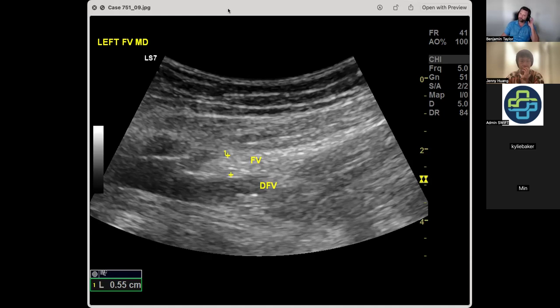But as time passes, there's a number of things that can happen. It gets brighter, it can recanalize, and you can get a more central channel. But also, if you think back to the DVTs you've seen, are the veins big or small? The clotted veins. Acutely big, chronically small. Yeah, so they shrink. Do you think that one looks big or small?